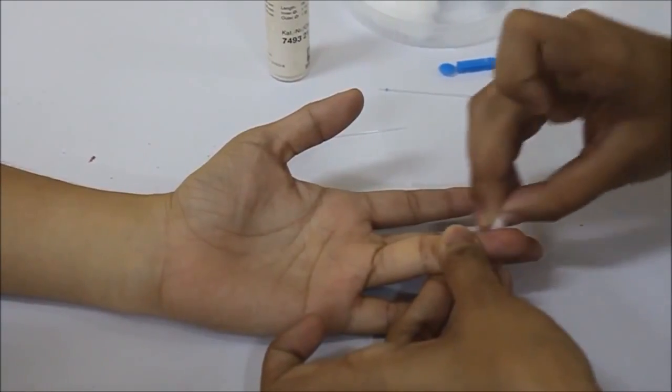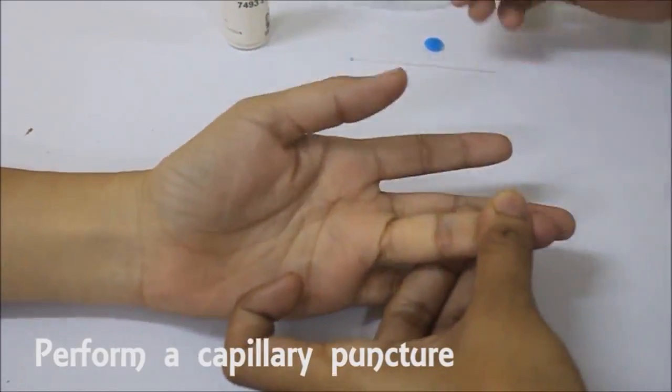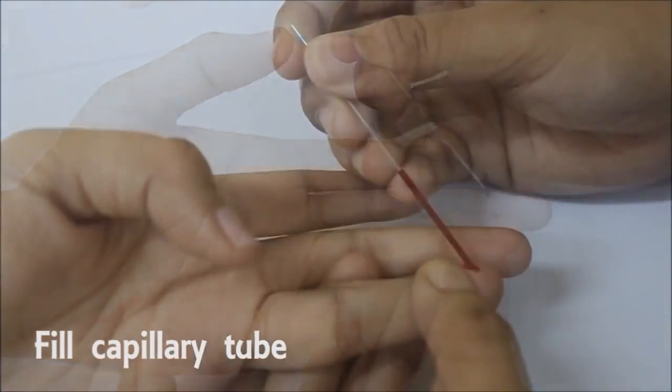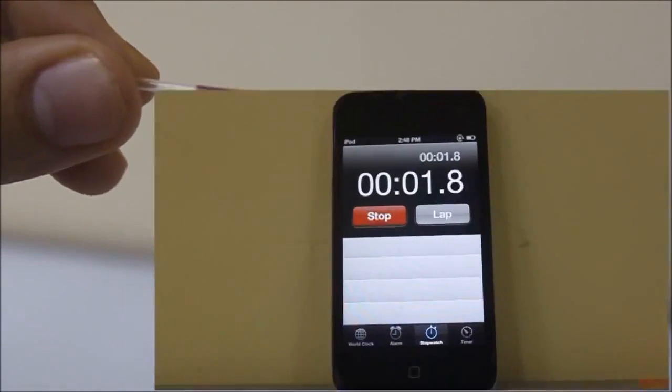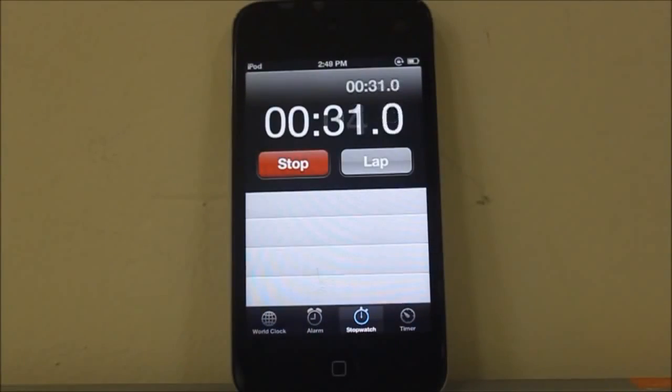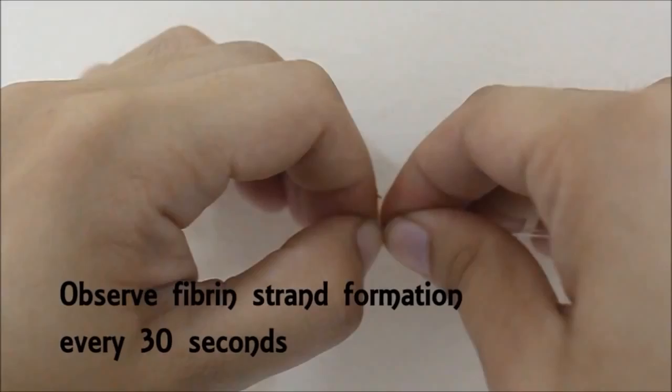To perform the capillary method, first, collect blood by capillary puncture. Fill up a non-heparinized capillary tube and start the timer. At 30 second intervals, break off a piece of the capillary tube gently.